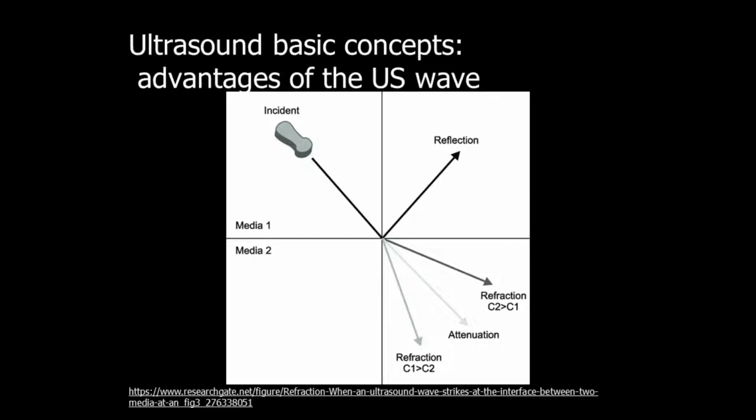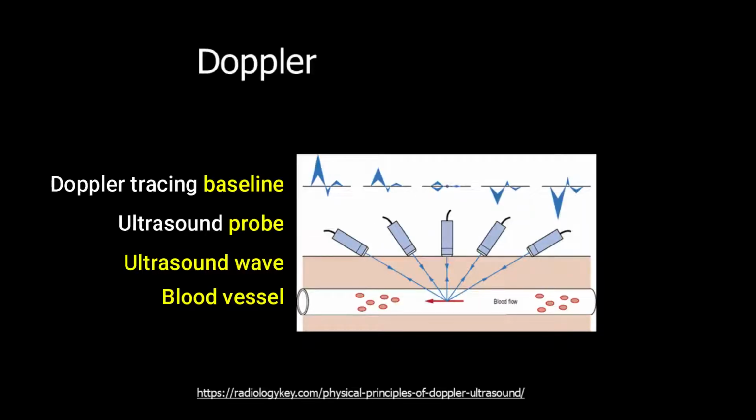Doppler could be useful also to analyze vascular structures. And the Doppler signal gets stronger the more parallel to the blood flow it is. As you can see, this is a very strong signal, described positively as the blood is directed towards the probe, and then when the probe is completely perpendicular to flow, no signal is registered. And if we change the angle and the blood is moving away, we will see, of course, the signal inscribing below the baseline. Again, color can be used to identify vascular structures with flow.